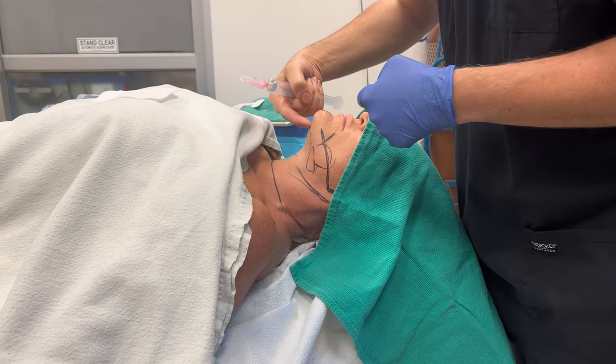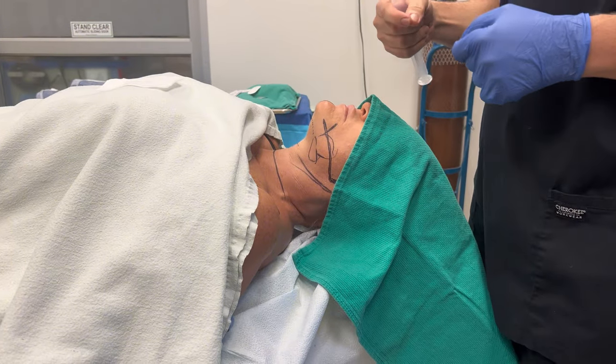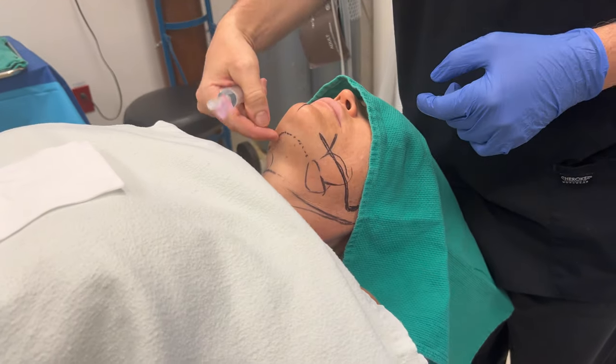I'll make an incision underneath the chin. This is something no one's ever going to see unless she looks up, so this is going to be a well-hidden scar.